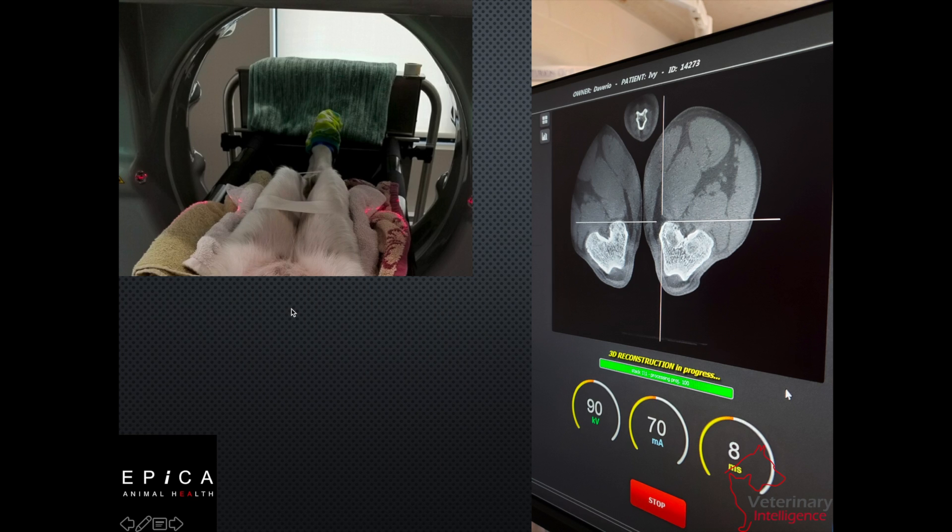Position-wise, this is what the animal is going to look like inside the gantry. We're going to have both knees as close together as we can get them. And once we complete our scan, our screen is going to look like this, where we've got both knees in view.